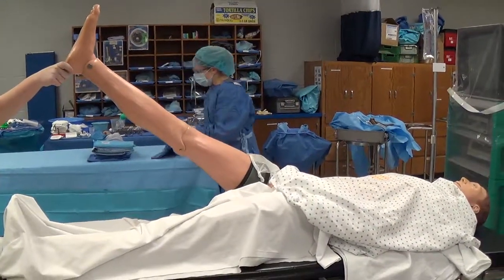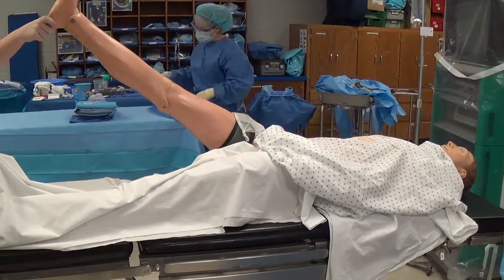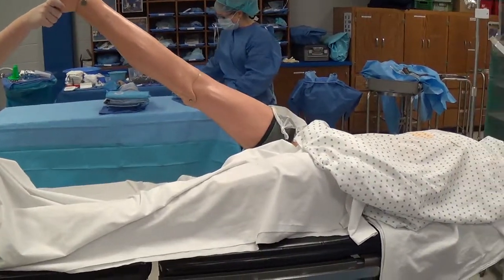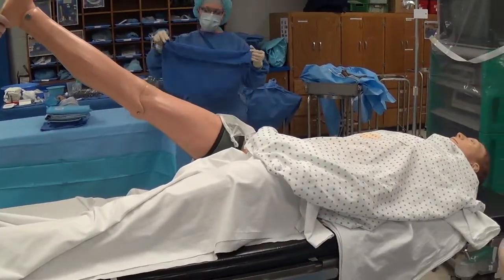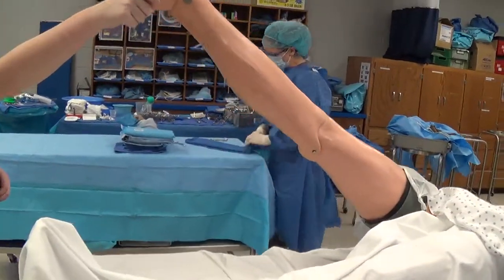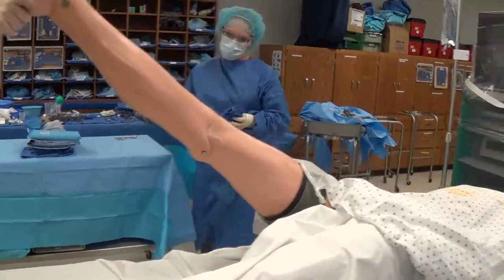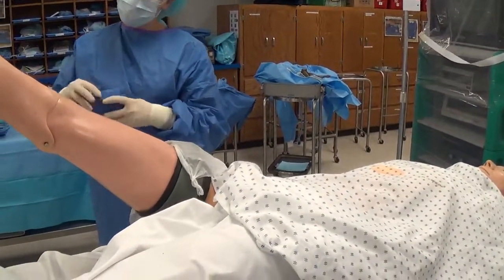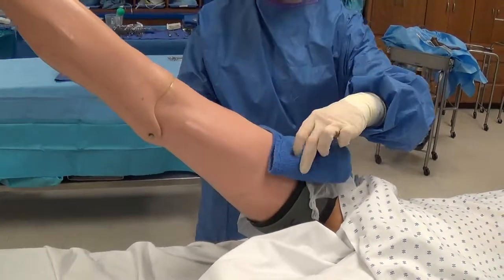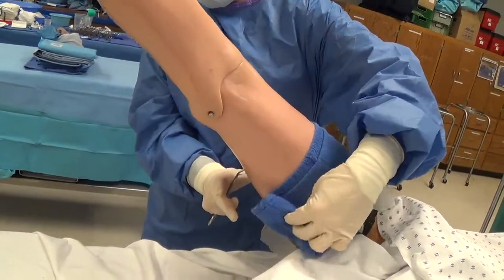Some surgeons may use what we call a roller towel, which is something we more commonly utilize on an upper extremity, but I'm going to show you how we put it on a lower extremity. It's a towel that's opened all the way, then we fold it in thirds on your back table, you're going to roll it, and then we will unroll it around the extremity as we apply it. You have to be very careful when putting this on because there's lots of risk of contaminating yourself, so make sure that you stay on the outside of the towel as it is applied.